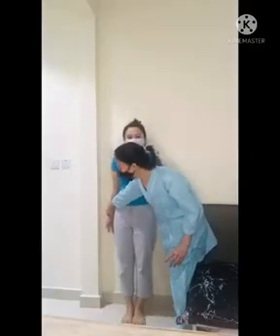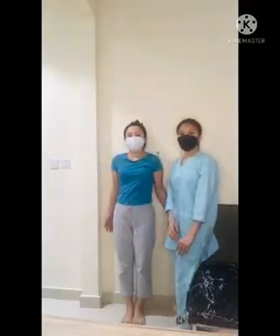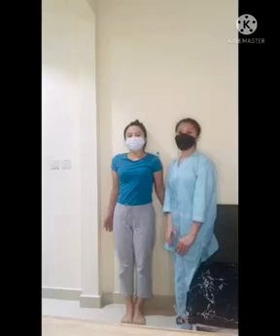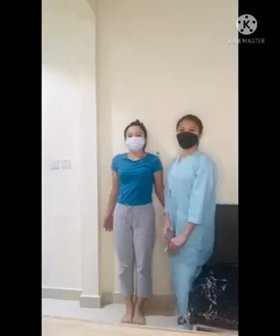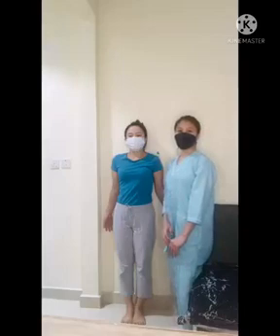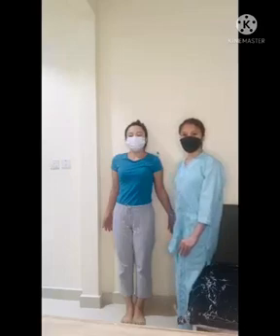Place the shoulders in the same horizontal plane. Both shoulders are taken for comparison. So, two exposures, with a weight of 5 to 8 lbs on the wrists with the use of an elastic band, and one without weight.